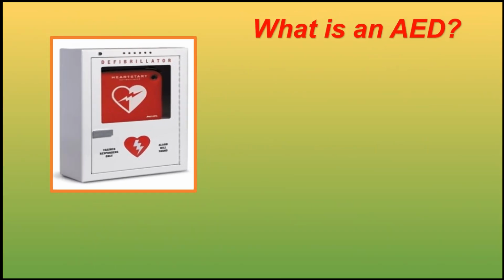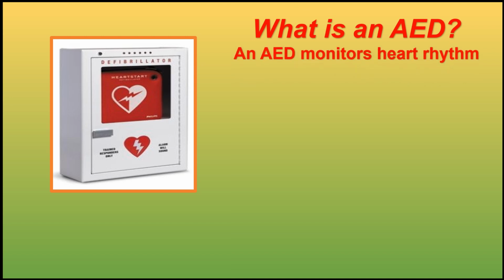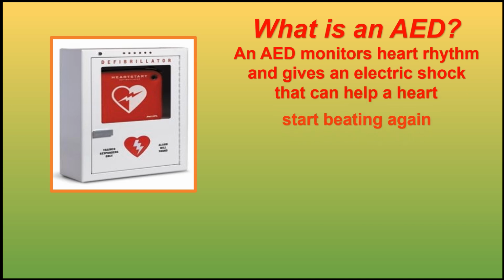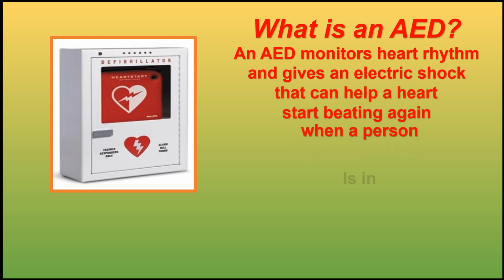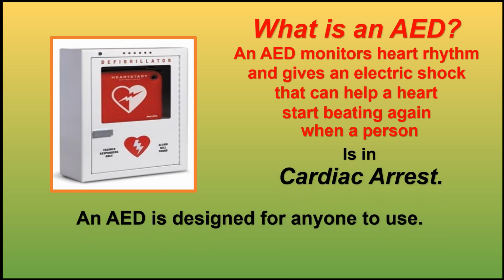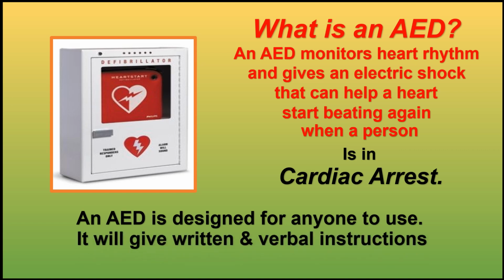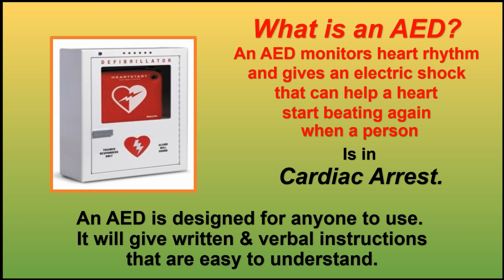What is an AED? An AED monitors heart rhythm and gives an electric shock that can help a heart start beating again when a person is in cardiac arrest. An AED is designed for anyone to use. It will give written and verbal instructions that are easy to understand.